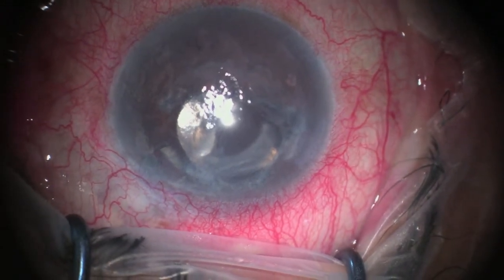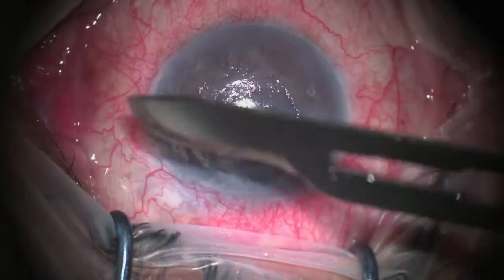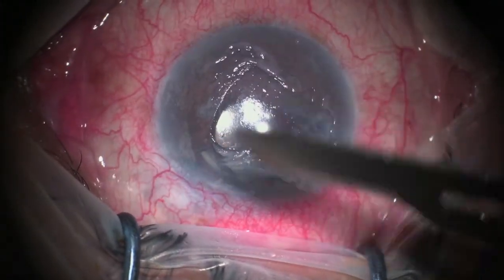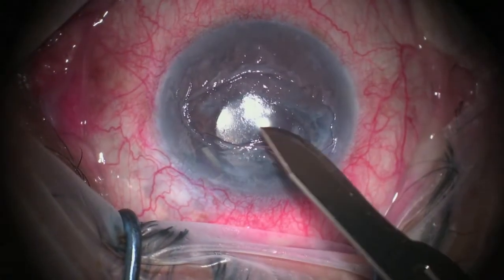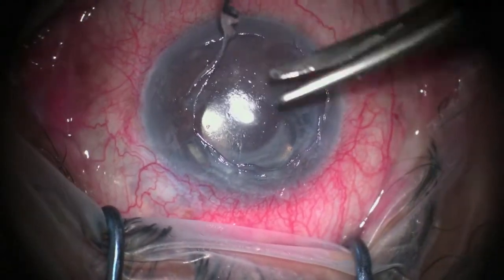The first step in this case is to remove the edematous epithelium for better visualization. Now it is evident that there is a large superior iris defect.